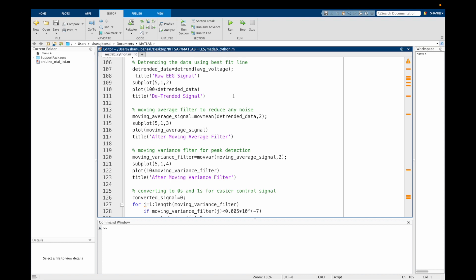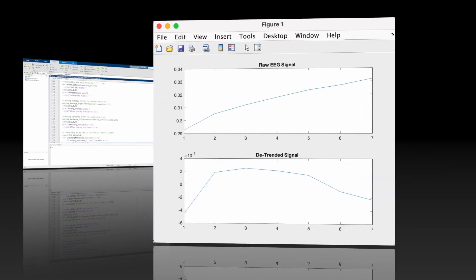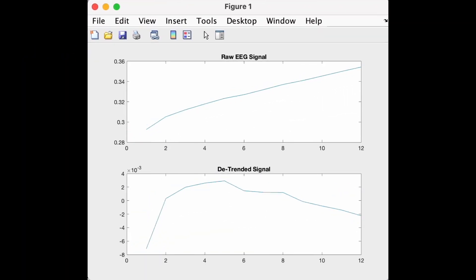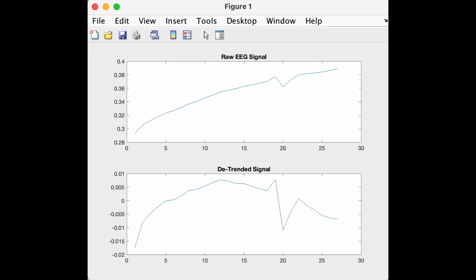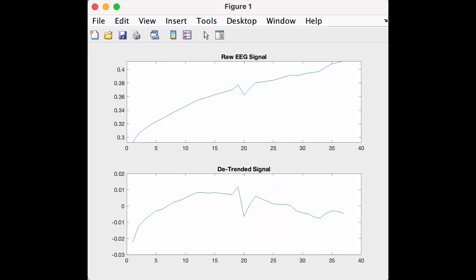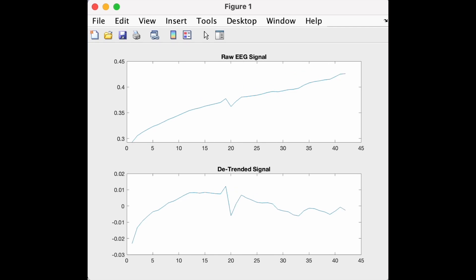To fix that, I have used this MATLAB command to detrend the data. Here it calculates the best fit line of the data and subtracts that from the data. Now this gives us the detrended data — let's have a look. As you can see, we have the raw data in subplot 1 and detrended data in subplot 2.